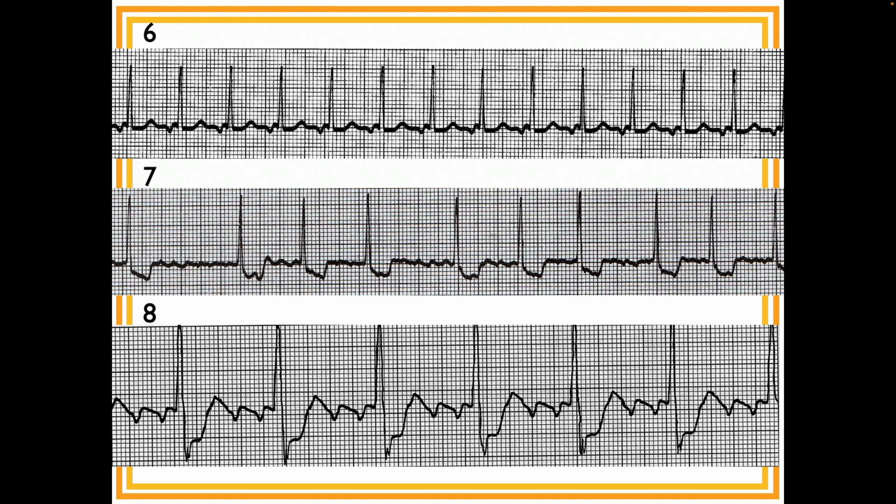It's possible, but I can't tell you. And the other thing is, if it's there, you probably wouldn't see it because it would just get buried in the T wave. Would it be fast enough to be within the ST segment right before that T? It could be. Yeah, absolutely could be.